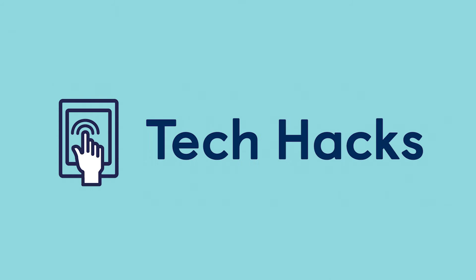TechHacks logo. A man is sat at his desk using his phone and braille keyboard connected via Bluetooth.